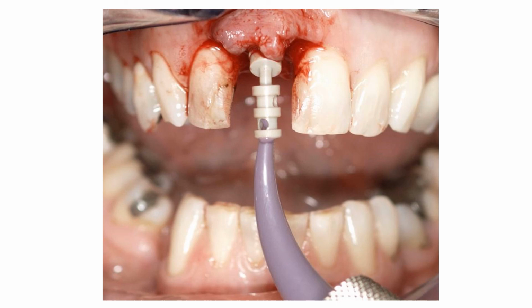The quick transfer can be positioned directly into the top of the implant, and in this situation Improgum hard is being used for our transfer impression. It is also worth noting that you can autoclave the Peek component prior to use if you're intending to use them in any surgical type procedures.